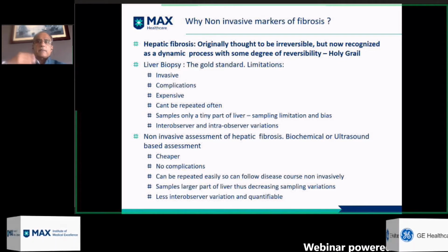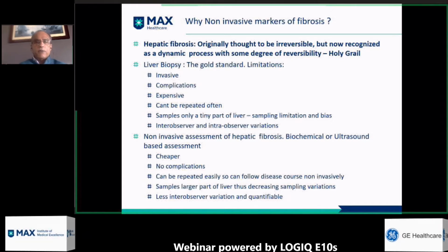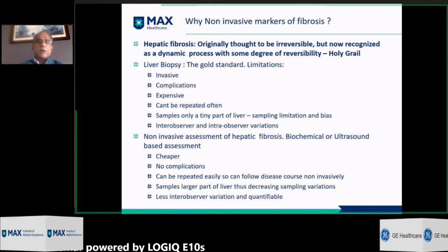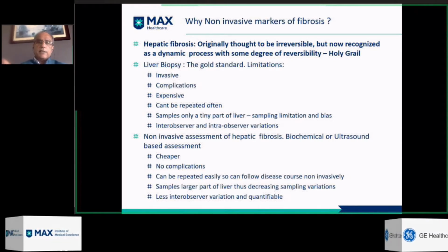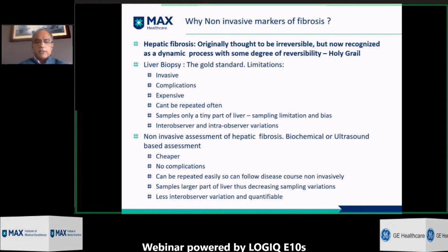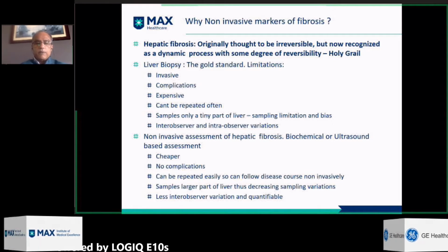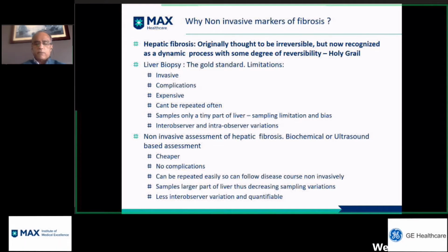And he comes back 6 months later, and with adequate effort and adequate treatment, these values have come down. It's very encouraging for the patient then to continue on those lines. Similarly, if the condition is worsening, which he hasn't taken adequate care, and he sees the numbers going up, it's very easy to then convince him to actually do the right thing in order to improve his clinical status and his disease progression, or to arrest the disease progression. So the quantifiability is a very important, useful parameter when we come to clinical practice in dealing with patients.